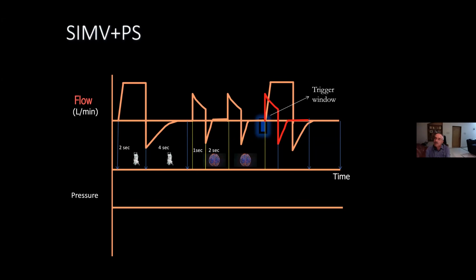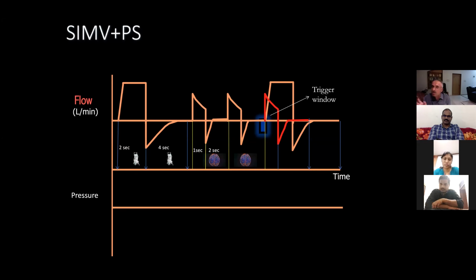So, whichever way you look at the ventilator, the patient is not having less work of breathing because of mandatory breaths. In fact, his diaphragm may get injured because after 1 second it starts going into expansion, because that is the neural control. The ventilator is pushing more air. So that causes what we call eccentric, or pliometric, diaphragmatic injury. So rather than decreasing the work of breathing, there is an imposition of a mandatory breath.